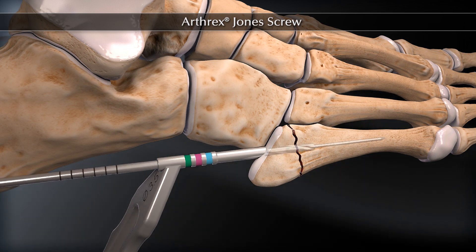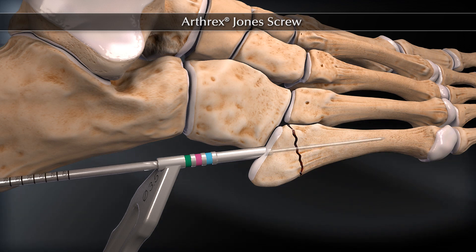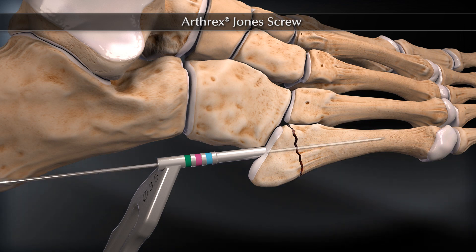Advance the 3.5 mm cannulated drill bit past the fracture site, checking under fluoroscopic guidance. Avoid penetration of the distal fifth metatarsal cortex.